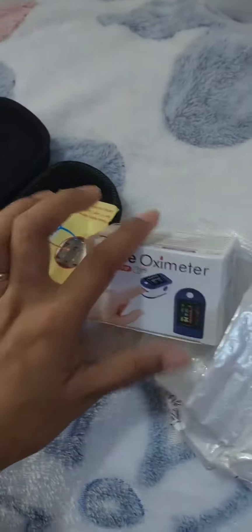Hello my dear sunshines, showing you the most important purchase that I ever made. This is the pulse oximeter, which is a painless, non-invasive item that can measure the saturation of oxygen in a person's blood.